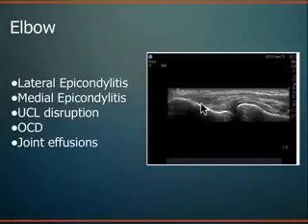So tennis elbow is really a tendon disorder. The term epicondylitis is a little bit of a misnomer, but what you're dealing with mostly is tendon pathology or tendon abnormalities. On tennis elbow, a lot of times you can visualize that tendon quite nicely, and this tendon has this fluid collection here, and disruption of the normal tendon fibrillar pattern. It's a little bit thicker. So this is a tendinopathy, or probably a chronic tennis elbow. And you can see that quite nicely here.